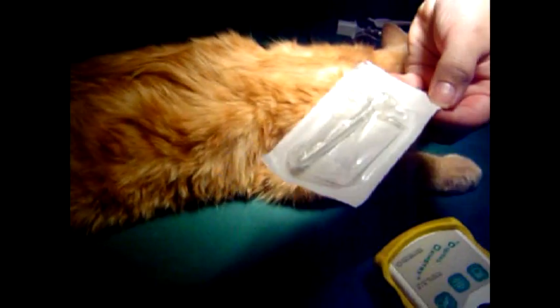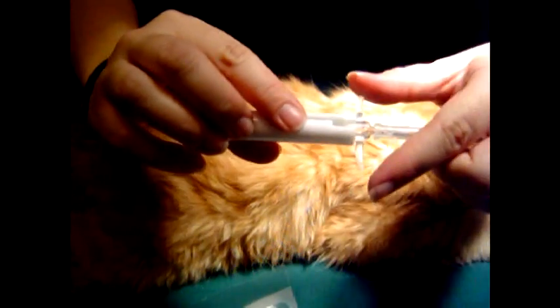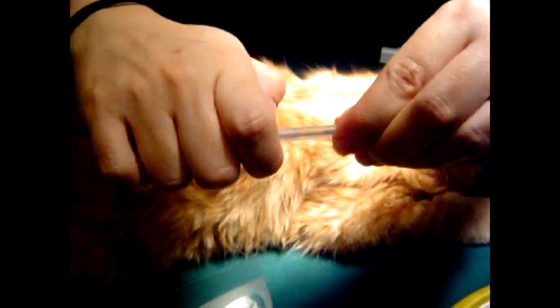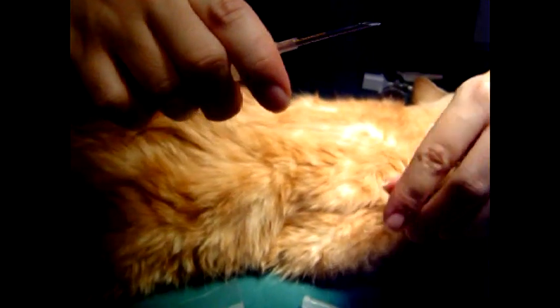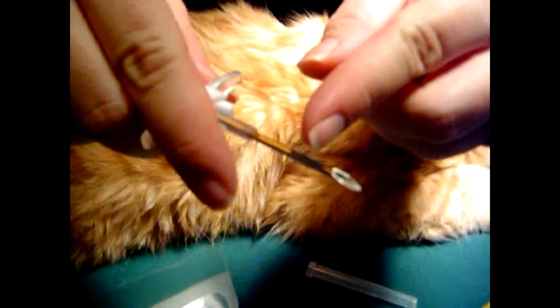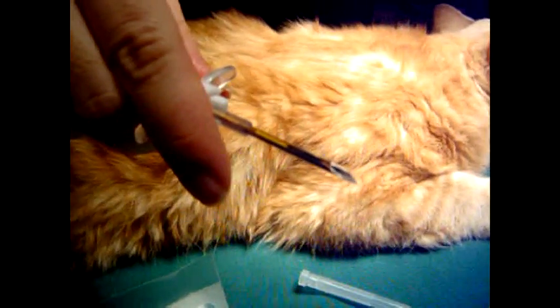Our microchip itself is in here. We're going to open this and put it on the handle, and then we're going to remove the cap. Our microchip is right here — you can see it from here to here. It's about two centimeters long.